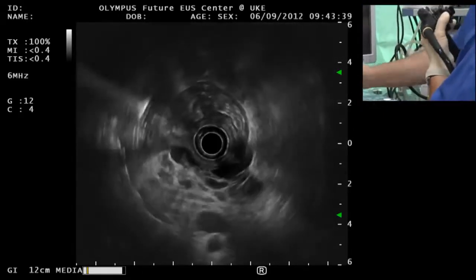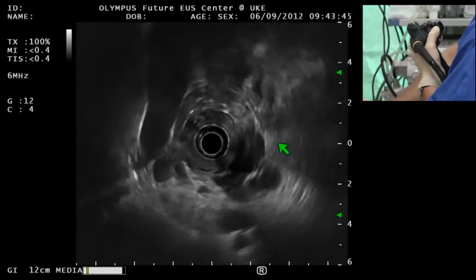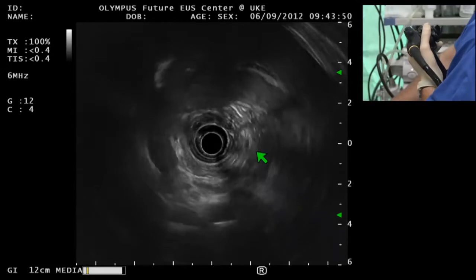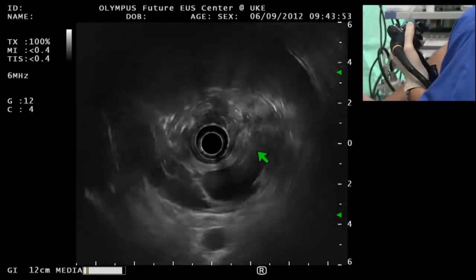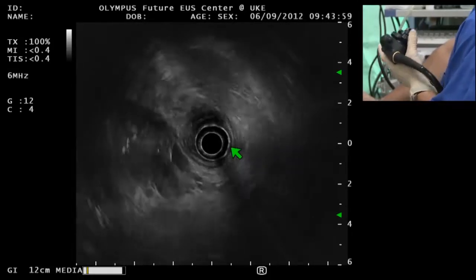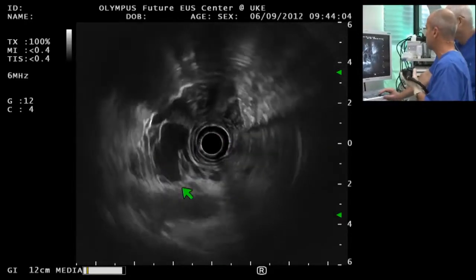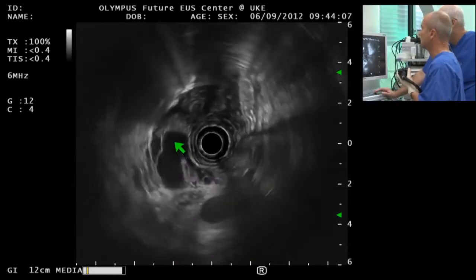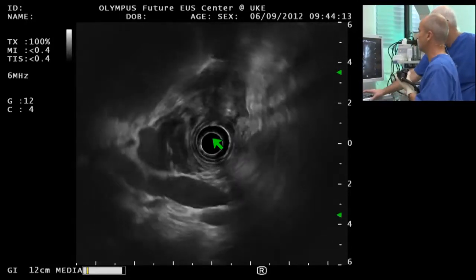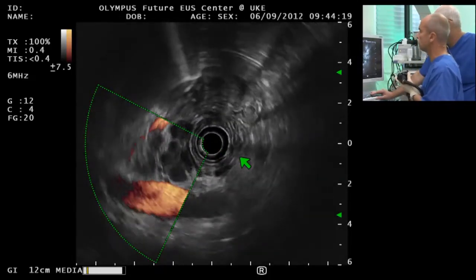We are now, at the beginning of the examination, you didn't see, we were up on the head of the pancreas, and you see that now we are even closer to the isthmus or the body of the pancreas. That's a very important point, because it means that it's not a cyst inside the pancreas, but around the pancreas. And if you consider that, the etiology of cystic lesions with such numerous spaces, moving, easily depressed, sometimes with fine calcifications in the walls, it is frequently either a mesenteric cyst or a cystic lymphangioma.